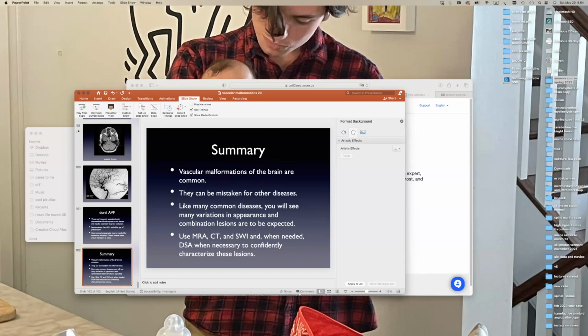So if you have a cavernoma, that could be the source of seizures. But I think that it's probably a red herring, unless, again, maybe you have a case like this where all the electrical studies point to the same location as a capillary telangiectasia. But in my experience, I've never seen a capillary telangiectasia that was a source of seizures.